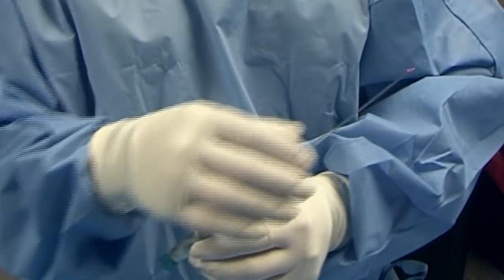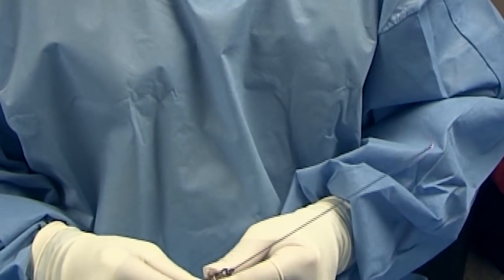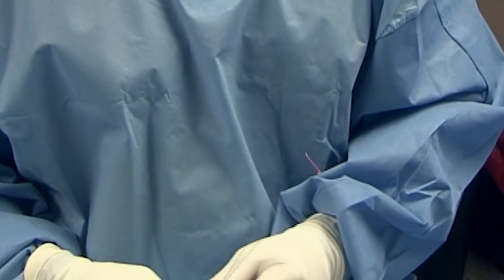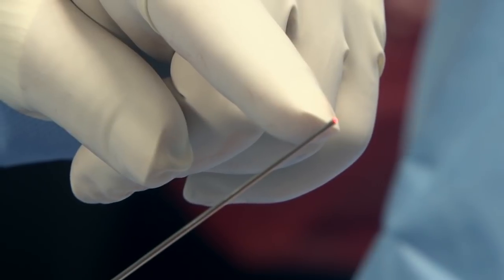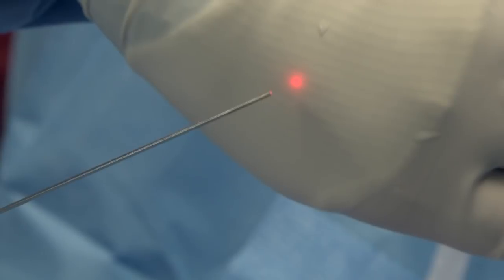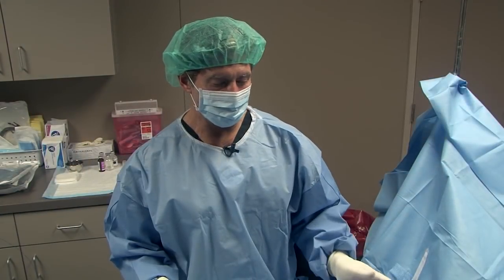This is the tube that will go through the tiny little opening, like we did with the numbing medication. You can see how tiny it is — it's actually even smaller than what we use for the numbing medication. And at the very tip here is where the laser energy comes out. We'll be placing this through the opening and laser all of the fatty tissue in the area.